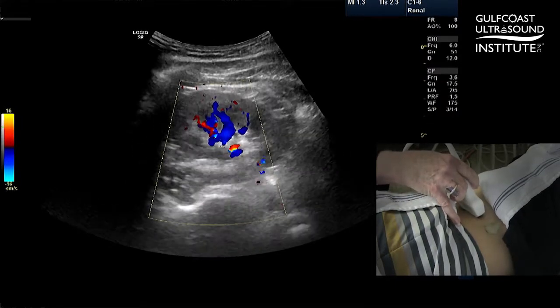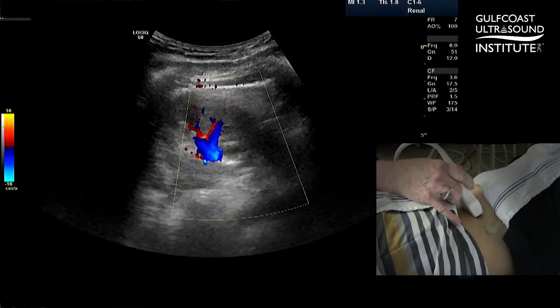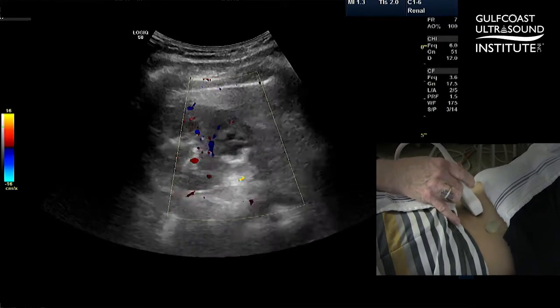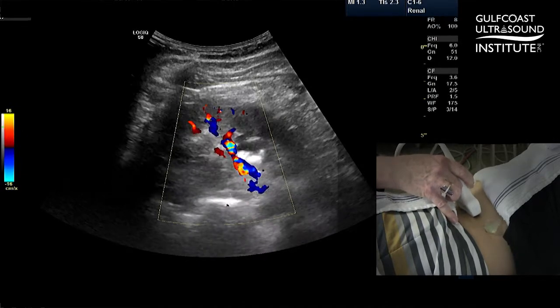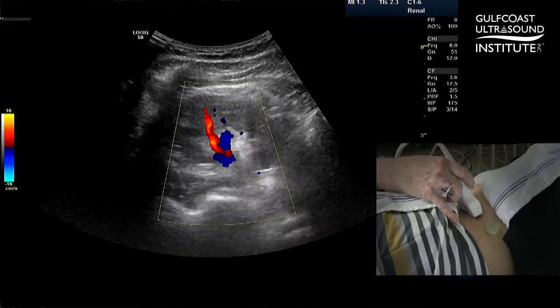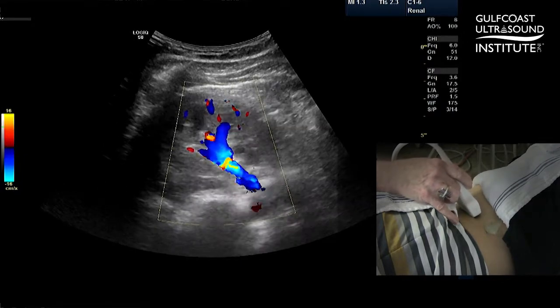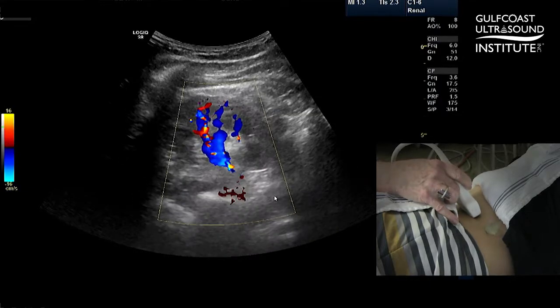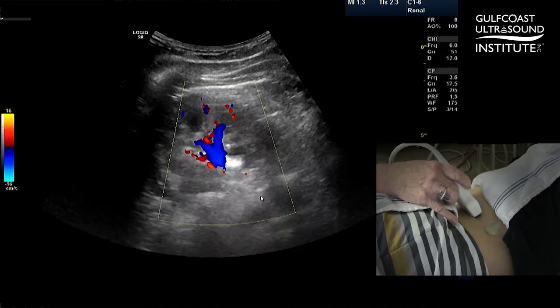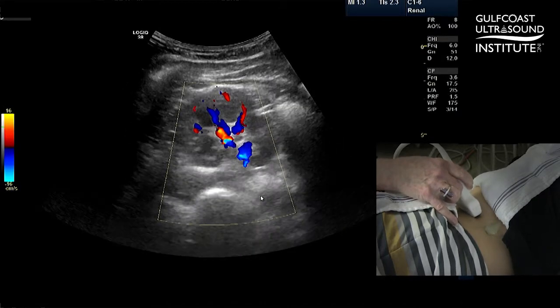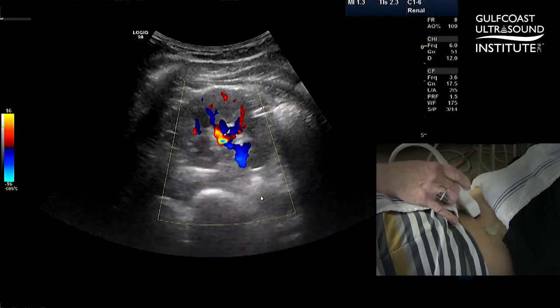At this position, if we bring that renal artery down to the aorta — take in a deep breath — we can see that the slight curvature is toward her feet, away from the spleen and down toward her feet. This is helpful if you don't see the full length of the renal artery. You can even follow the renal artery based on the Doppler signal simply by tracking with Doppler along the course.